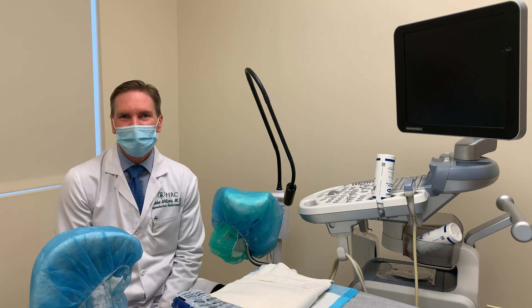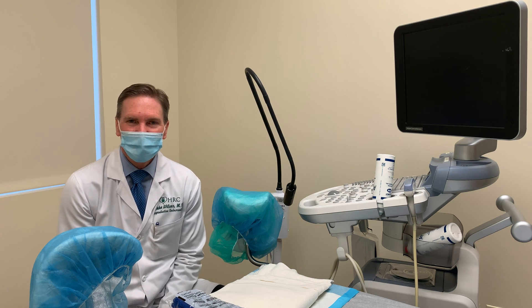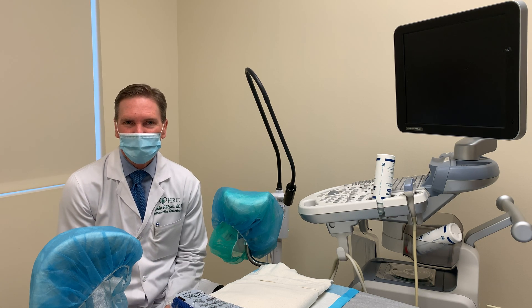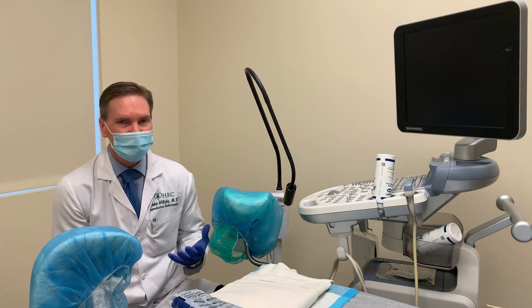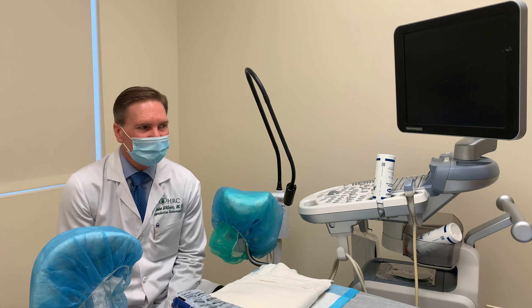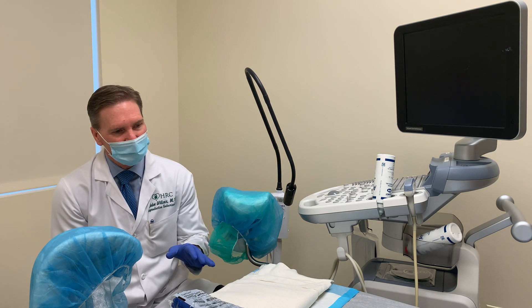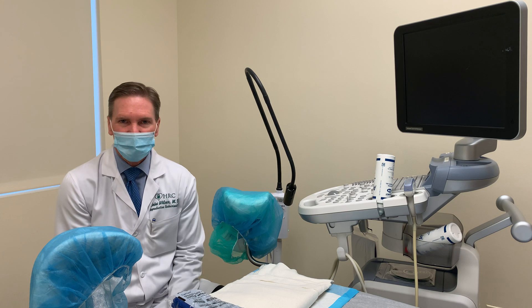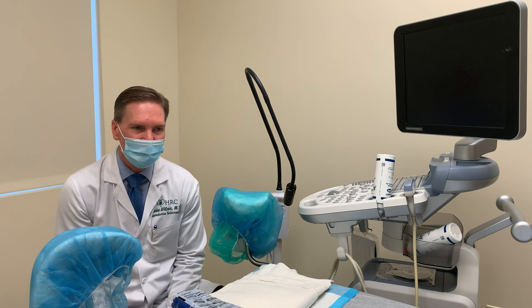A lot of patients are curious how do we get the embryos in the uterine cavity after the embryologists have helped us grow the embryos to viability. We're here in one of our transfer rooms at HRC and we have an ultrasound, we have a table, we have the ability to put the stirrups up and position the patient so we can do the transfer.